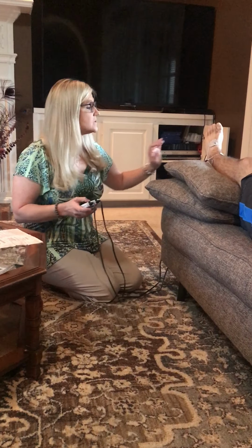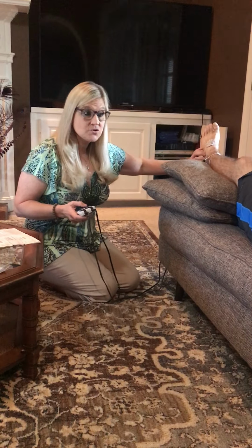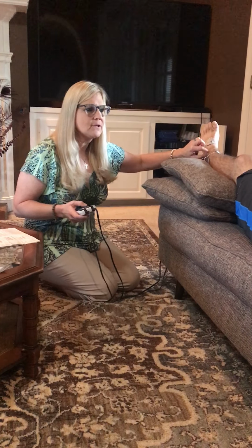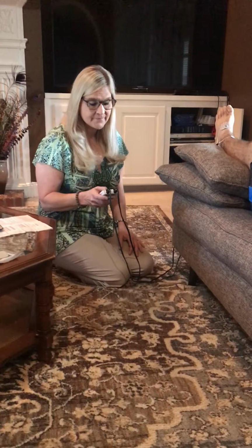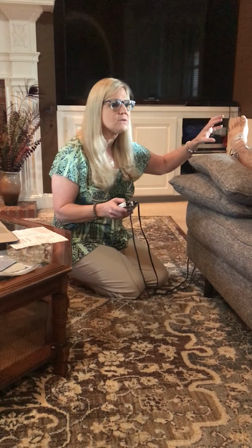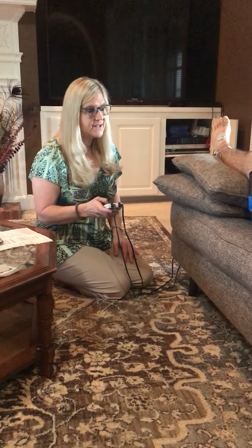All right, so I'm going to start turning up the intensity, and what I want you to feel is muscle twitch, a very strong sensation of like little ants crawling and kind of massaging the area. Okay, so tell me when you feel it. Feel it. Okay, tell me when it feels like a strong sensation or little kind of twitches but not painful. No. Okay, all right, so is that good?